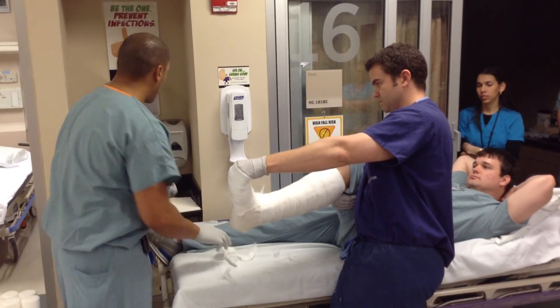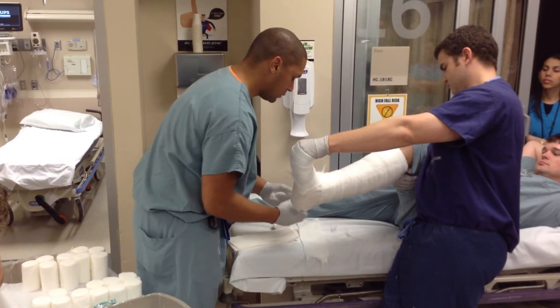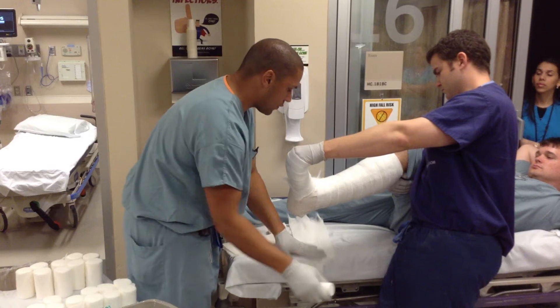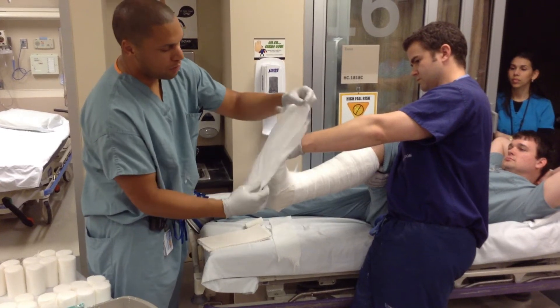Then do a soft roll over to keep the ace bandage from sticking, which makes it prettier and helps hold everything in place while you're getting it all together. Stop short there, and then it's time to put the foot plate on. Everybody does the foot plate a little bit differently — I do several layers of four-inch just to make sure it's all covered, then drape it over the holder's hand.